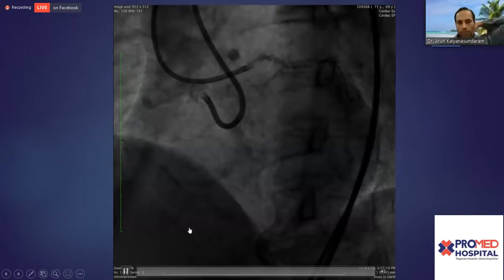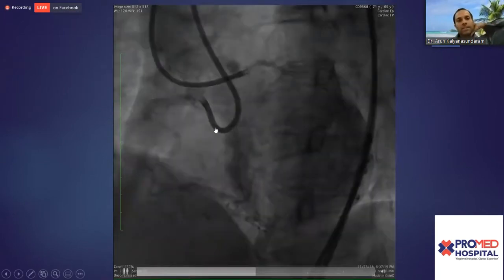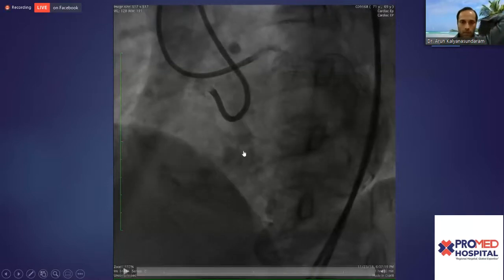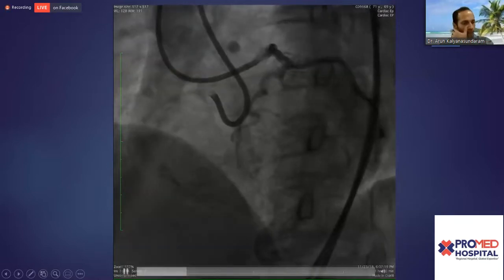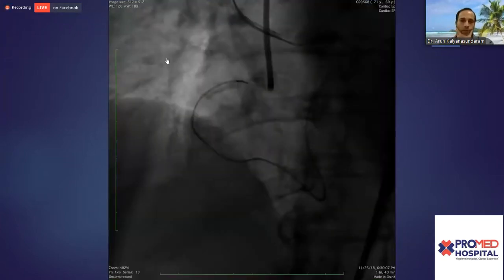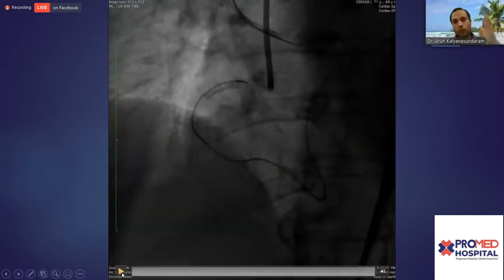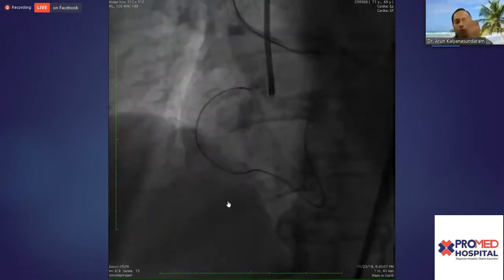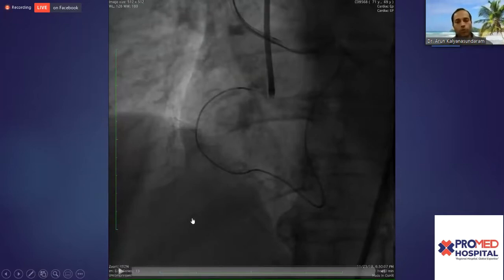This again was a case from a few years ago, an ostial RCA done in a foreign lab. As you can see, super calcified right coronary vessel, cross the collateral. Here was great. This was truly a flush ostium. I had nothing to go antegrade. So there's only one way. You've got to go retrograde true to true. So once this was done, managed to penetrate this.